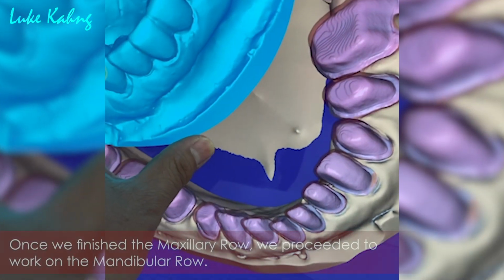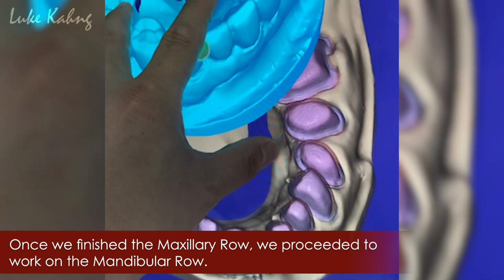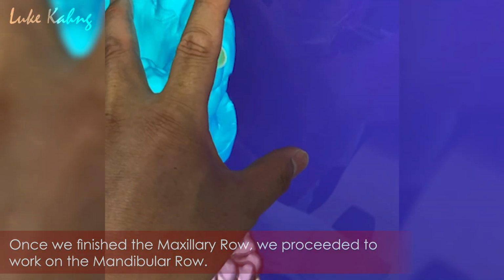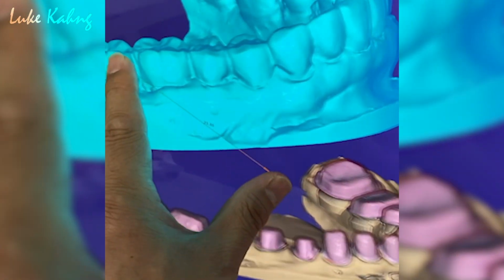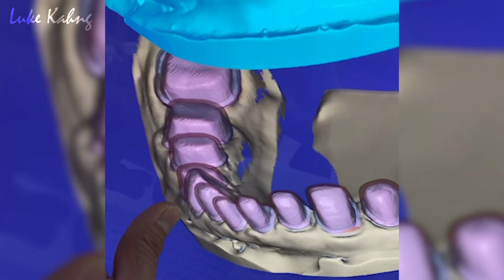All right, this is a kind of unique full mouth lower done with my hand. Follow the wax up. This, change it, move it.